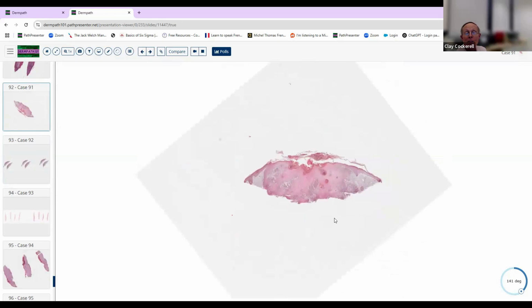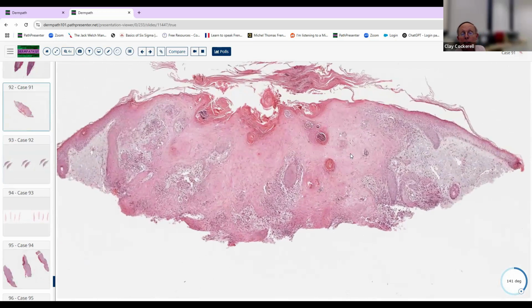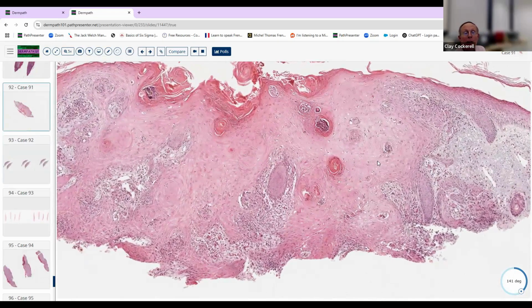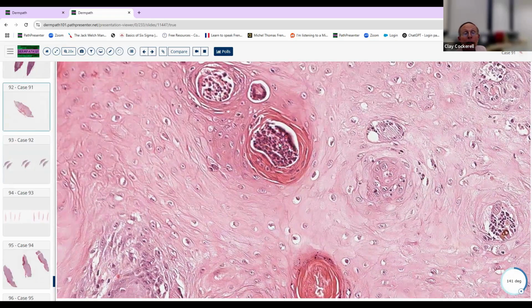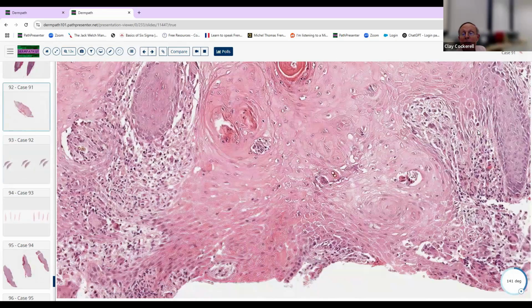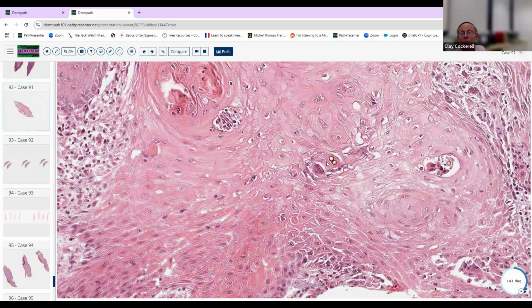Once again, a lot of pseudocarcinomatous hyperplasia, suppurative granulomatous dermatitis, neutrophils. We're going to look for organisms again, right? Bugs, pseudocarcinomatous hyperplasia. Where are we going to look? We look in the neutrophilic areas, like right here. Any bugs in there? Not so sure. Let's look down here. Ah, now we have some inside a histiocyte.